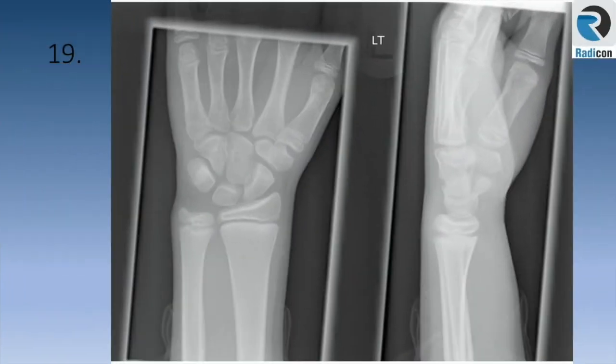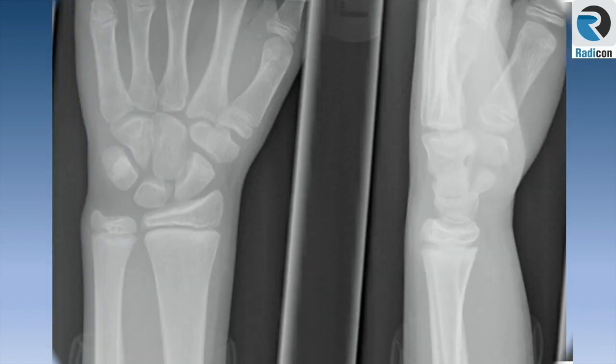Case 19. Images of the left wrist, immature skeleton. The zoomed-up image shows no significant abnormality. It's a normal film.